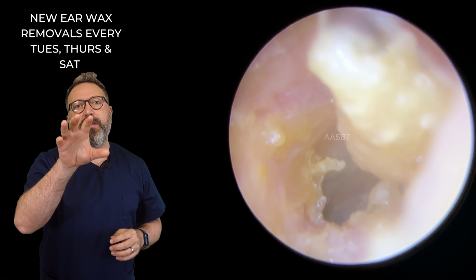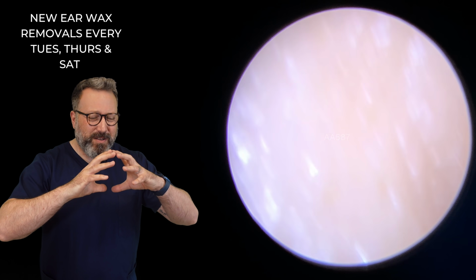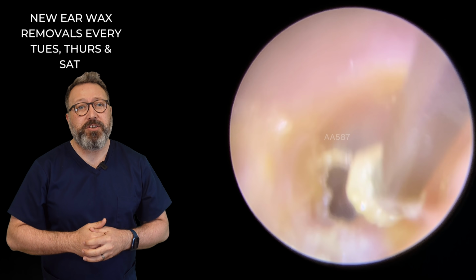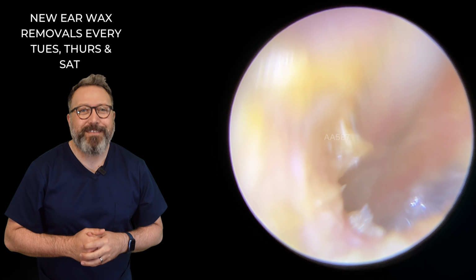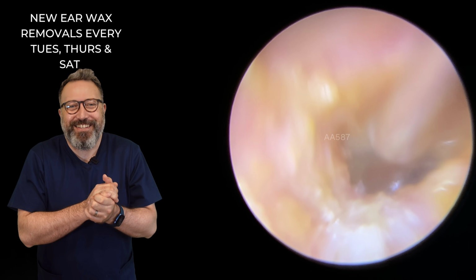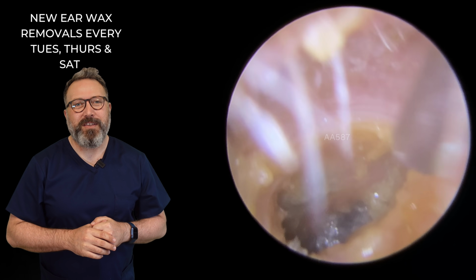So you can see there was a lot of dead skin down in the recess as well. That particular object had plugged the ear canal so well that it just wasn't able to get all of this past it. But yeah, the patient had, I can't tell you that, but it'll give you away. I'll tell you that story next time. But yeah, we're just trying to get these last remnants around here.